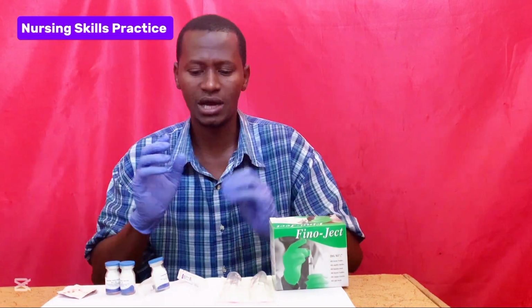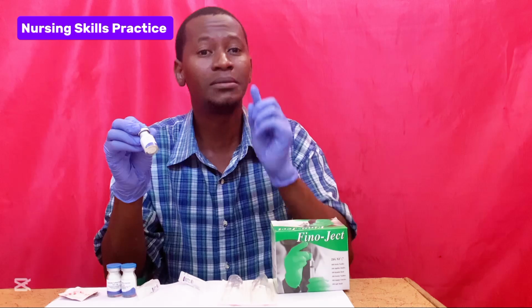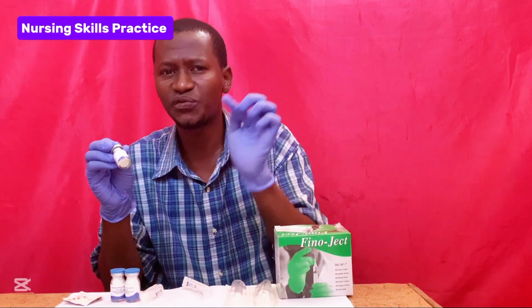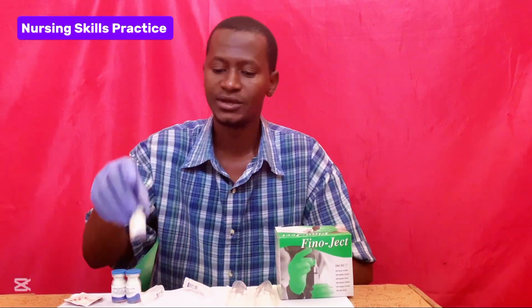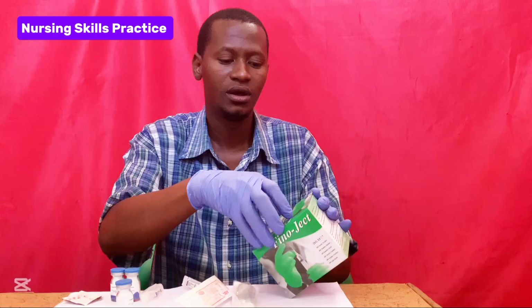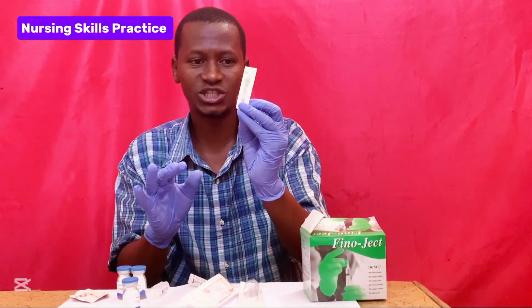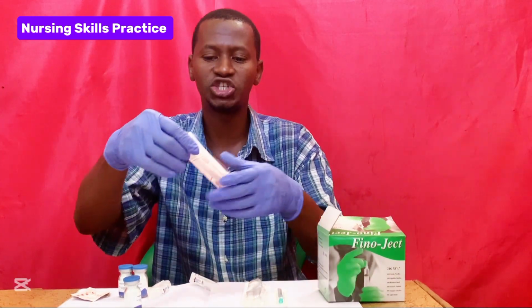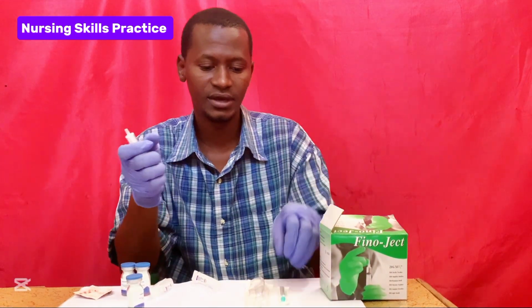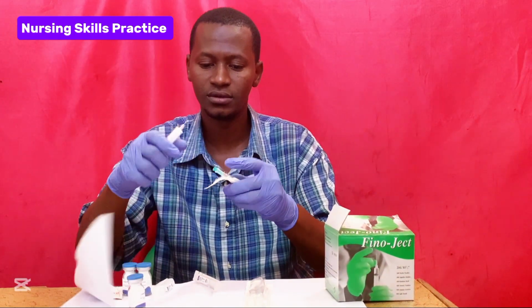Okay, let us start now. For the 250 milligram powder for injection, you can prepare by adding 2.4 ml of sterile water for injection. So what you do, you get the syringe together with the 21 gauge needle. You remove the syringe from the manufacturer's packaging, you get the needle, then you attach it to the syringe.